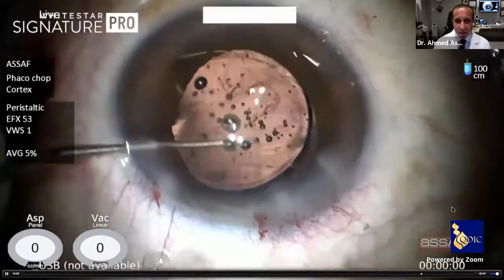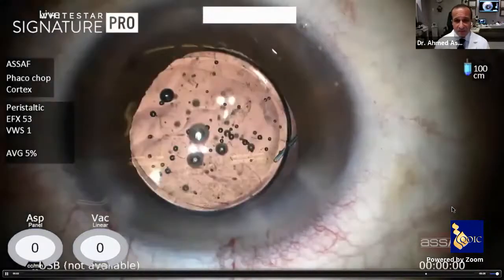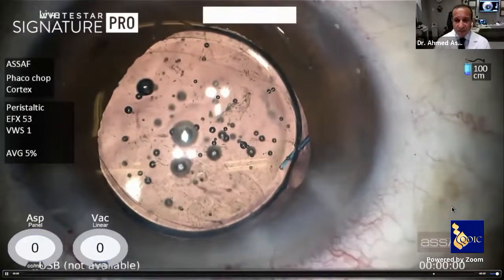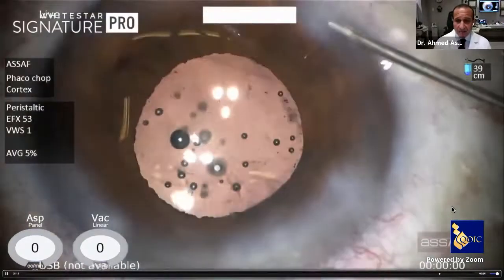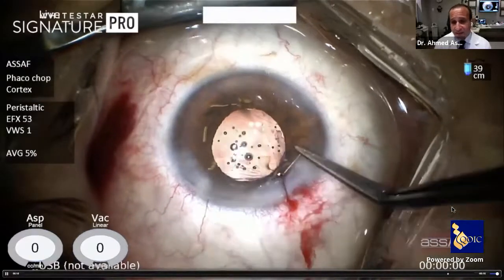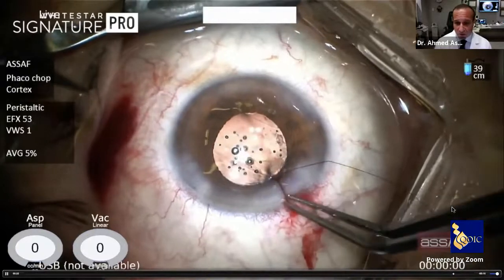And this is the moment that I like to do the optic capture. As you can see, by doing the optic capture, the lens is pretty well centered and the rhexis has been turned to elliptical in shape, denoting successful optic capture. Don't forget that most of these eyes are highly myopic eyes, and maybe they have a large diameter, and the sulcus sometimes is larger than the overall diameter of the three-piece lens, so it's preferable to do the optic capture before the conclusion of the surgery.